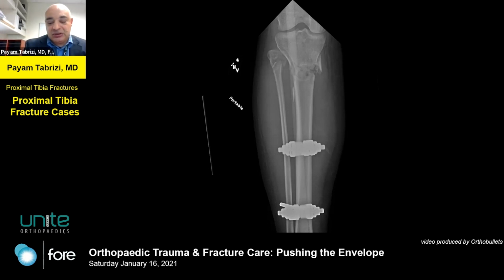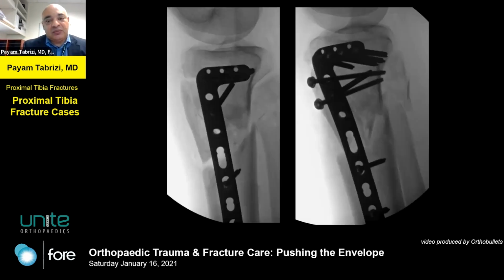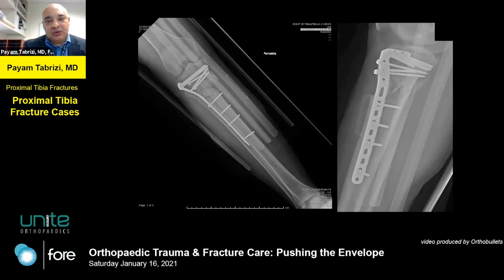So on this, we took him to surgery, left the X fix on, did a lateral plate, and bridged the fracture. You can see we used a screw to compress the plate to the bone. He did have a tibial tubercle piece, so some front to back screws for the tibial tubercle. But it looks like possibly it's a little bit distracted looking at the lateral view. So I put him in a brace. This is early on, so it looks okay early on.